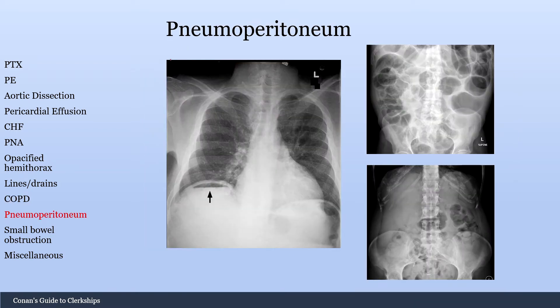So pneumoperitoneum — this is free air as a result of perforated bowel. You can see here you have free air under the diaphragm, as we've seen in a prior image. One common thing to mistake for free air under the diaphragm is actually the stomach gas bubble. Often you can see some food and then an air bubble right here. That is not free air under the diaphragm — that is just air within the stomach.